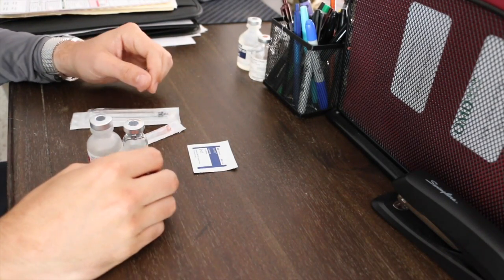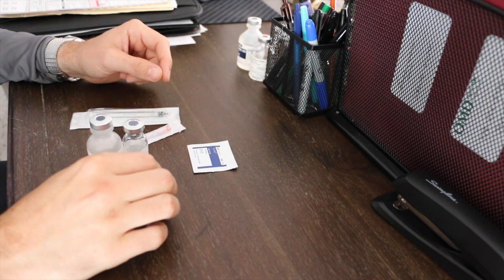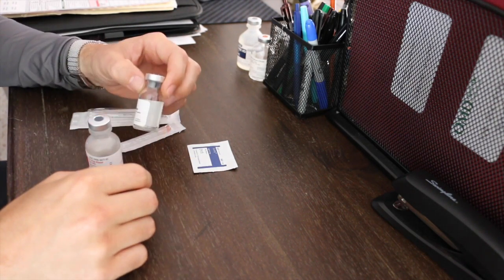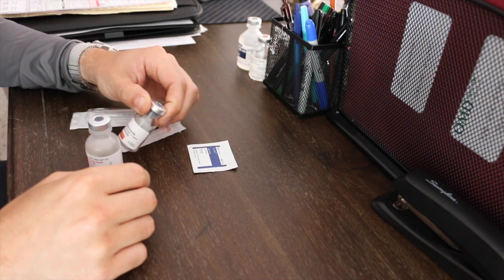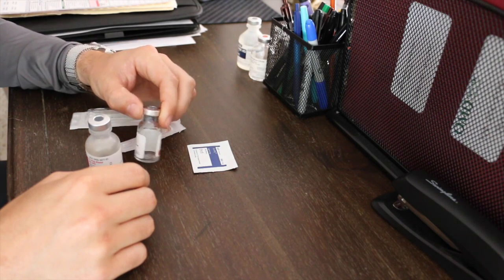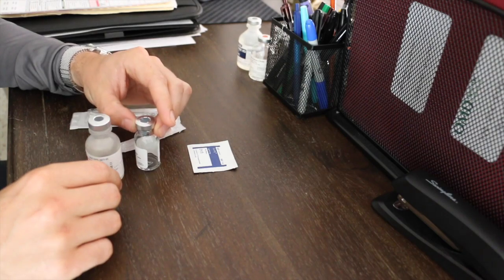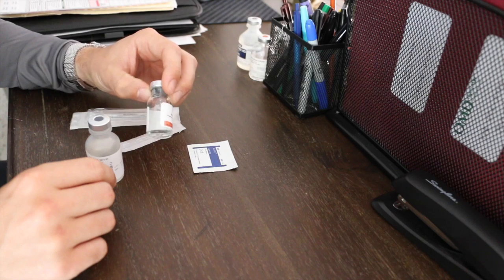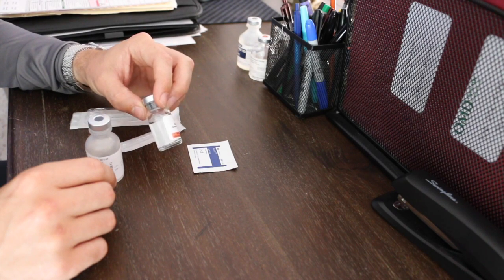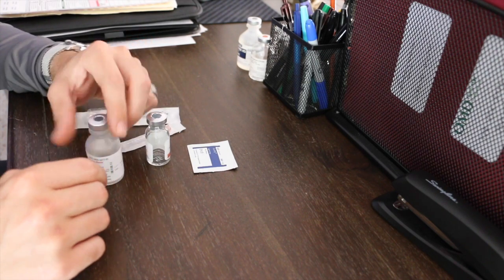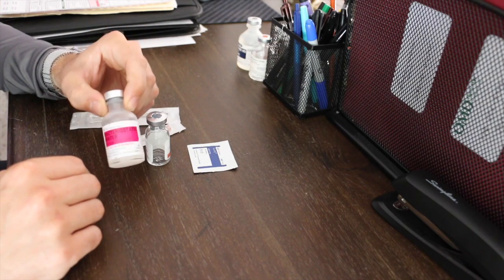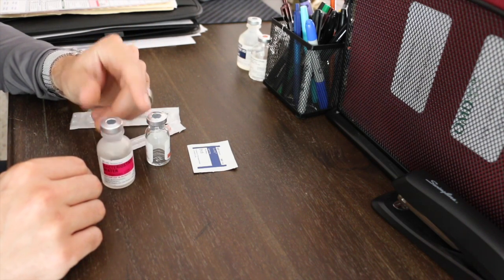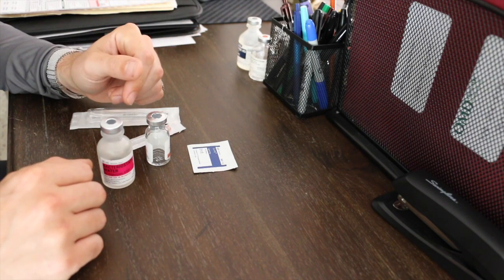Hey guys, just a quick video on how to reconstitute anything really that you're using. This is HCG, human chorionic gonadotropin. Compounds that you get from compounding pharmacies come in crystal form and need to be reconstituted with bacteriostatic water to return them to a liquid form for injection.